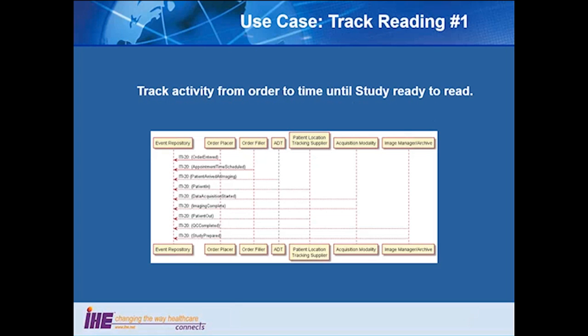And from that, what we will end up able to do is track several kinds of activities. One that was identified as feasible and valuable is to track all the activities that happen between when you place an order for a study and when that study is ready to read.